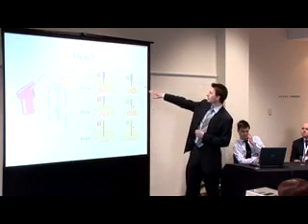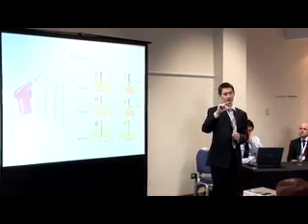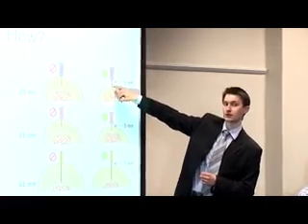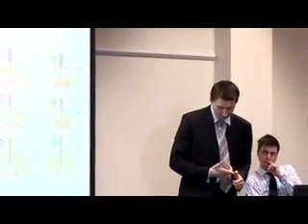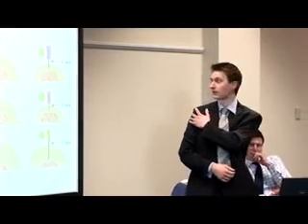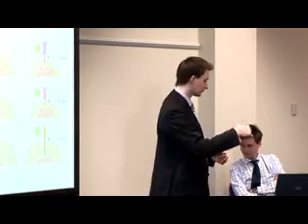And what we're wanting to do is, at the point where the needle is touching the cortex of the bone, you should be able to see at least one black line out with the skin. Okay? So you should have at least 5 millimeters out with that. Reason being that if you've got less and you start drilling, you're just going to go partly into the cortex, but not all the way through. So in the distal tibia, you're generally going to be using the smallest adult one, so the blue one. In the humerus, big, muscly people, you might be using the larger one. But all you need to remember is at least one black line being visible outside the skin when you start, okay? Once you're touching the bone part.